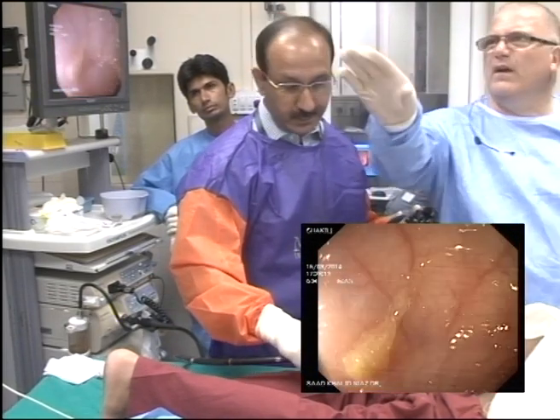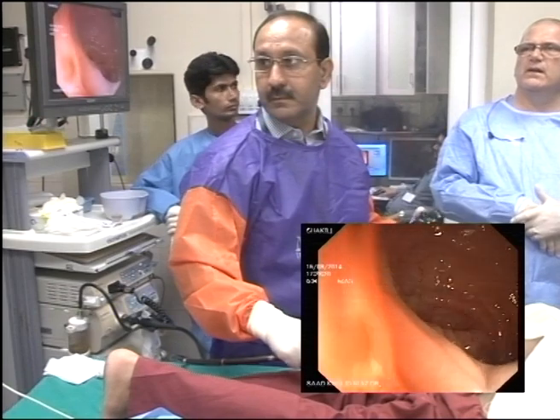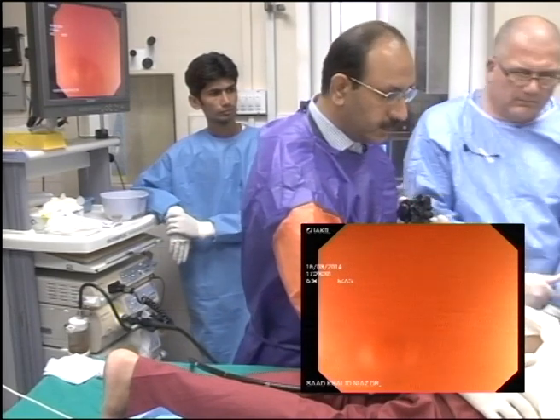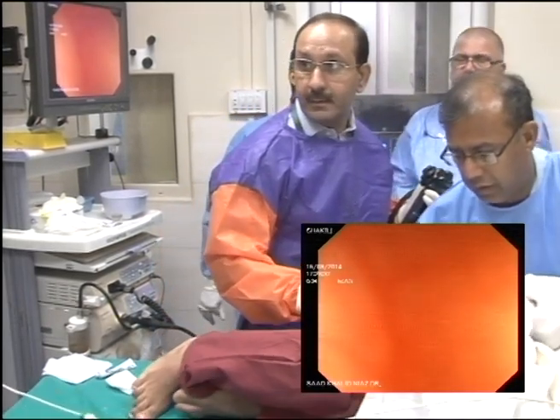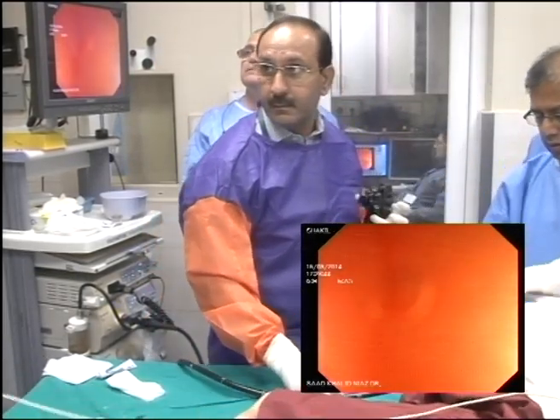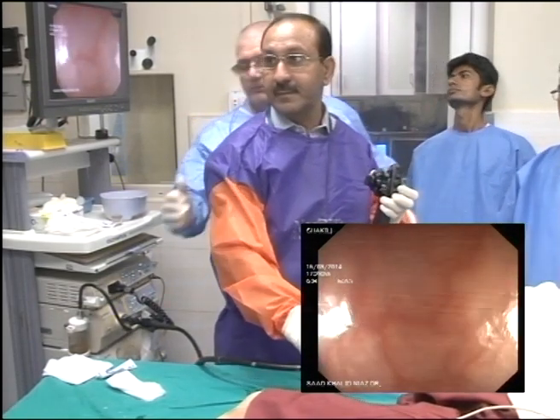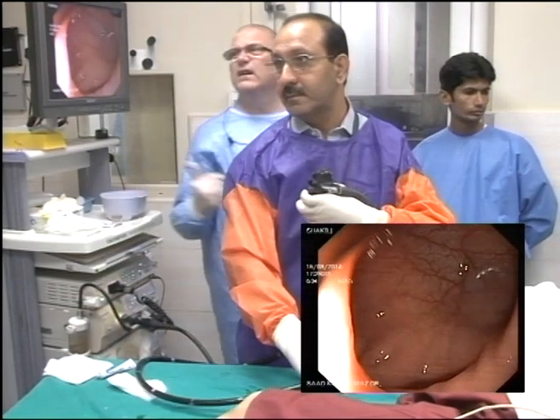That's where we were causing a lot of trouble. We did the polypectomy. Do you remember? Keep coming. Keep coming. Now, at this bit, put him back onto his left because you're nearly into the rectum. There, see, it comes back as soon as you put the scope onto the trolley. There, see?